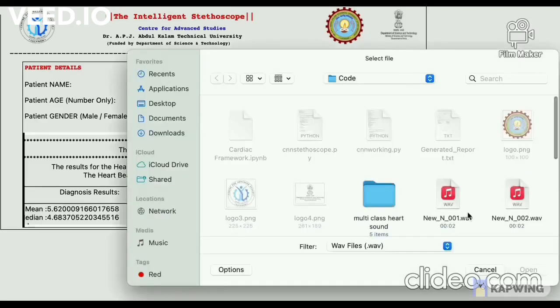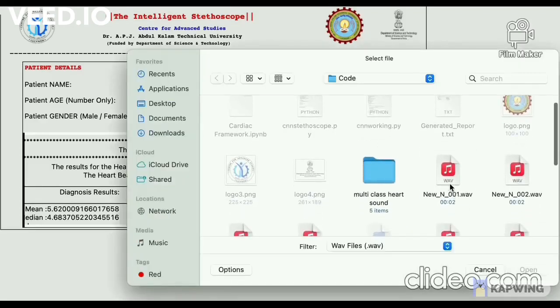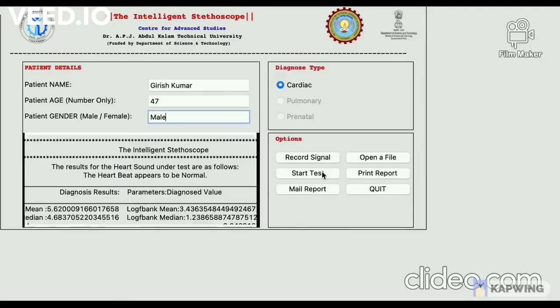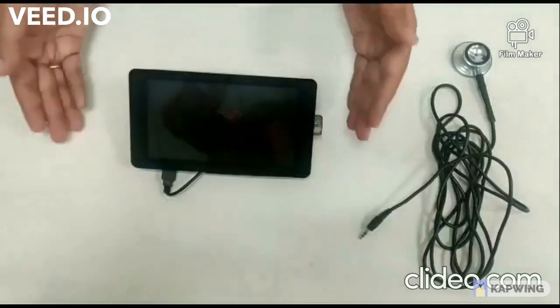Click on open a file if you want to open an already recorded signal. The signal is shown on the GUI. Click on start test.